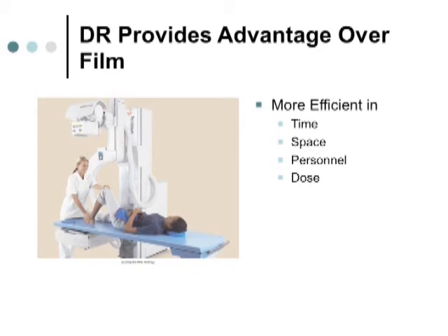The biggest hurdle that digital radiography had initially was how to store it. We didn't have computers big enough, we call it a PACS system now. We didn't have computers big enough to store these images because each image, a JPEG image, right, has a lot of information in it, a lot of data. So that was the big hurdle, but they came out with jukeboxes and all sorts of things to store the images, so they've gotten over that. So faster time, because we don't have to process the films anymore, takes up less space, less people, and lower dose.